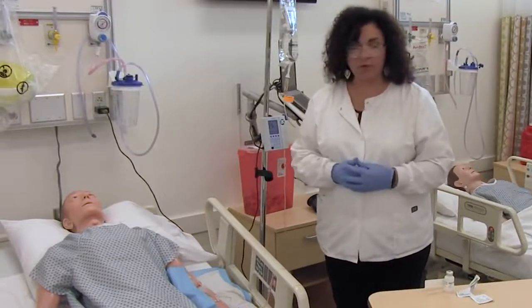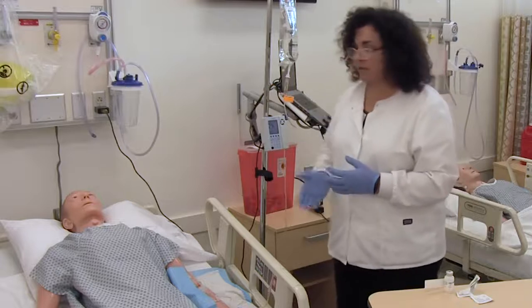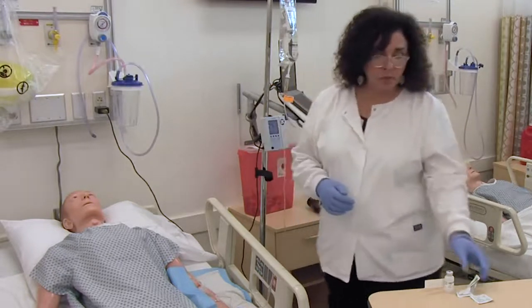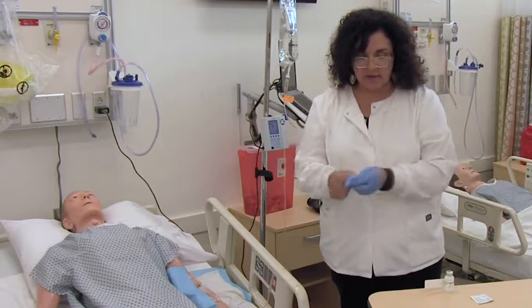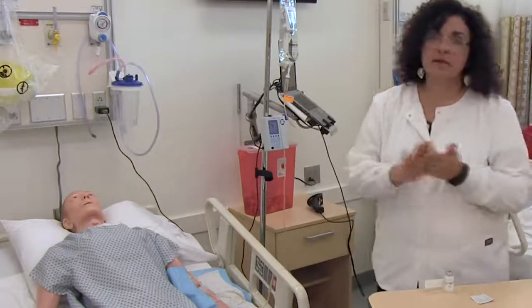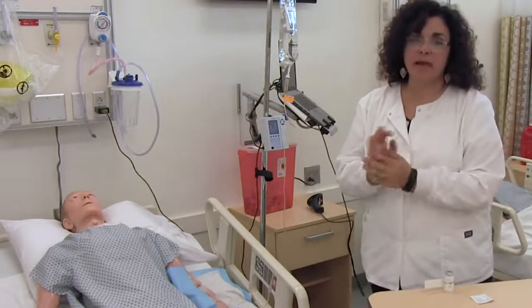But after you've given the medication, the primary fluids will continue to flow, and we will just put our patient in a position of comfort and safety and keep a close eye on the patient, and that completes the administration of the IV push Toradol.